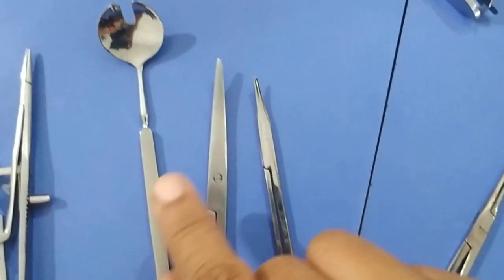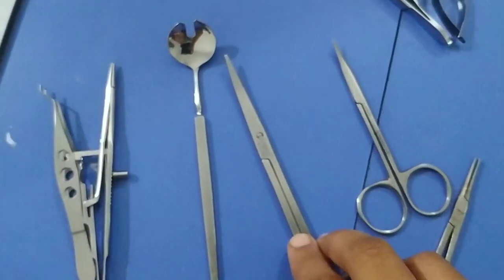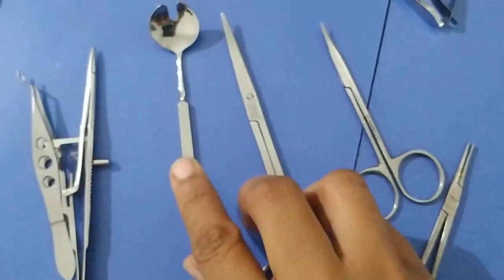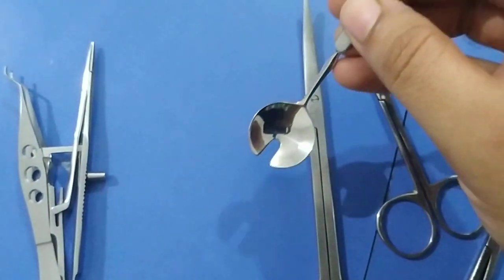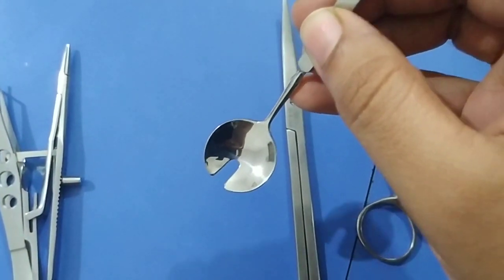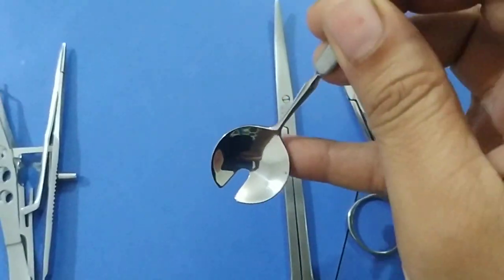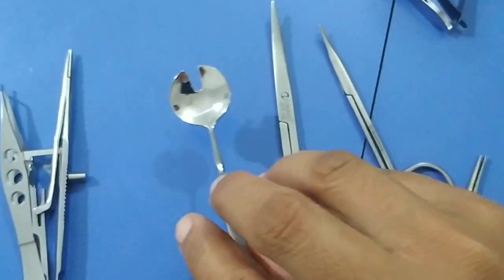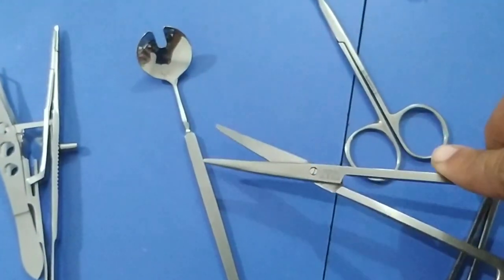This is an optic nerve guard and this is an enucleation scissors. The enucleation scissors are quite stout. The optic nerve guard is used during enucleation surgery to pull the globe upward, and then beneath the optic nerve guard you insert the enucleation scissors and cut the optic nerve.